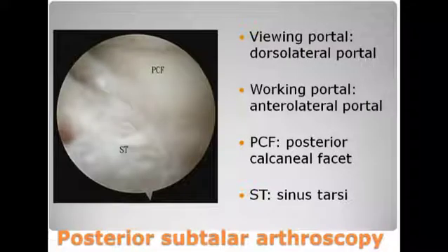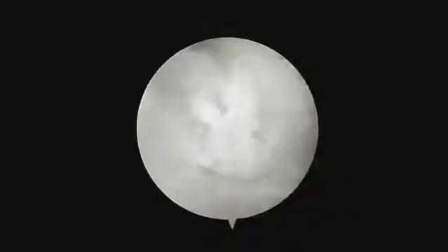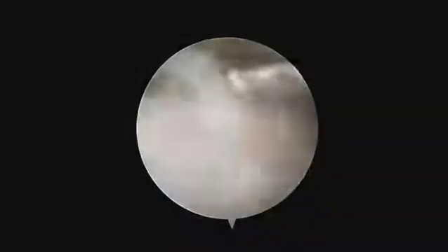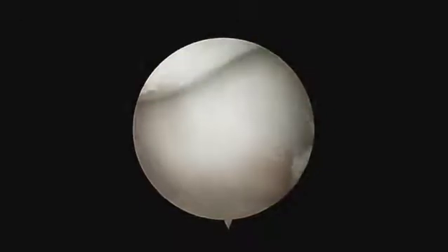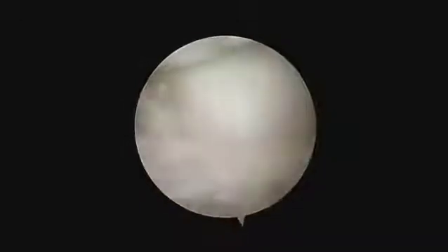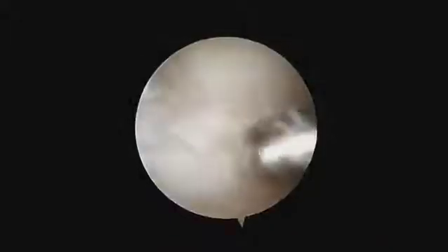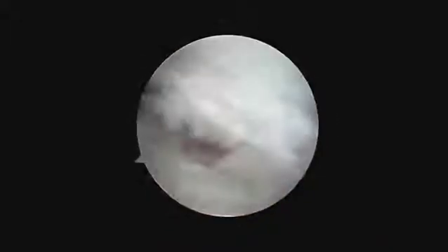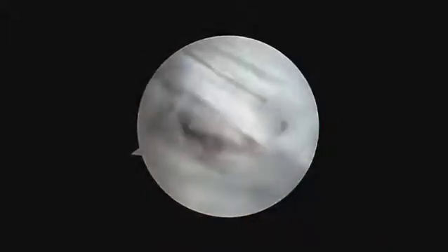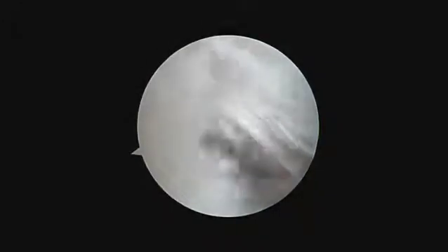Finally, the arthroscope can be switched to the dorsolateral portal. This can provide a wider view of the lateral side of the sinus tarsi, and the sinus tarsi can be debrided of any inflamed tissue, scar tissue, or torn ligament.